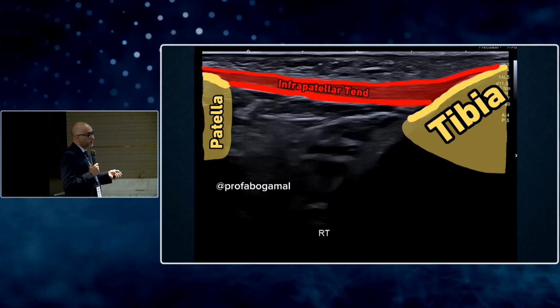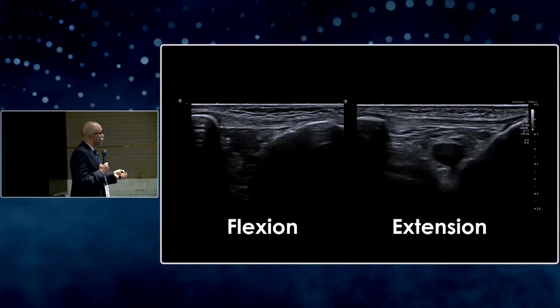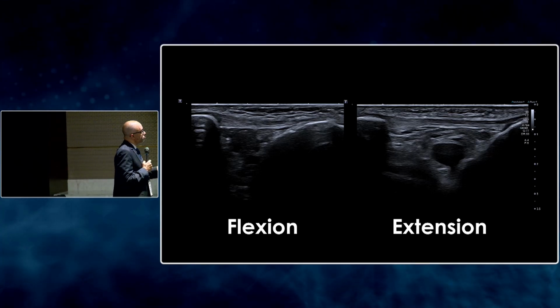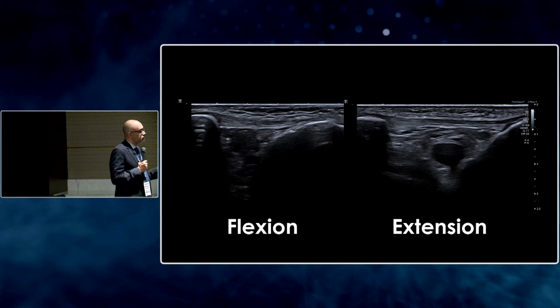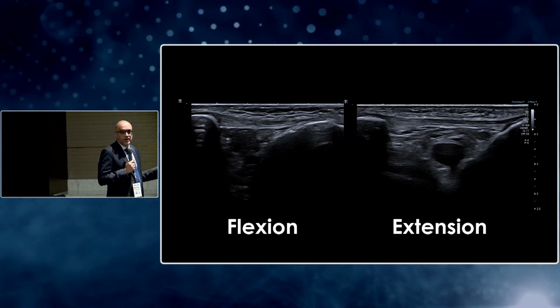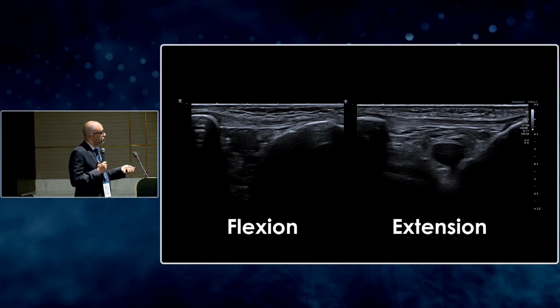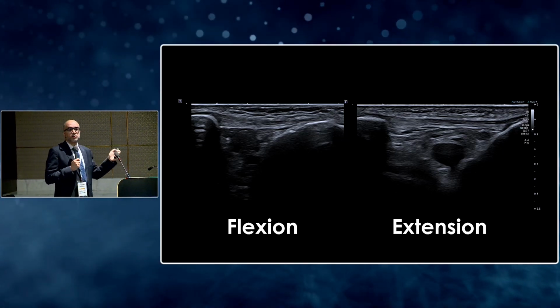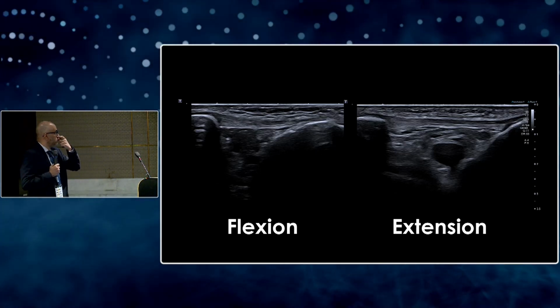If you can see, this is actually a picture taken at 30 or 40 degrees. But we look for the patient in complete extension. You can see an intra-articular cyst or ganglion that is causing impingement. This was the diagnosis. If you can play this video, please. Hello, IT? If you can click on the video.